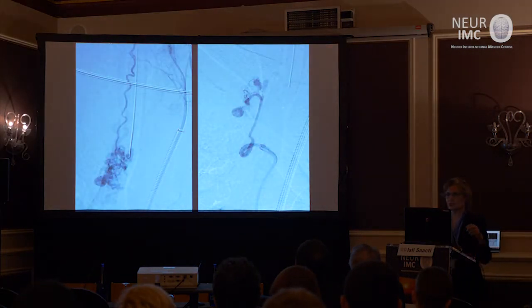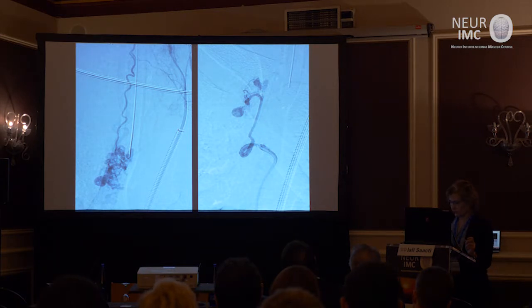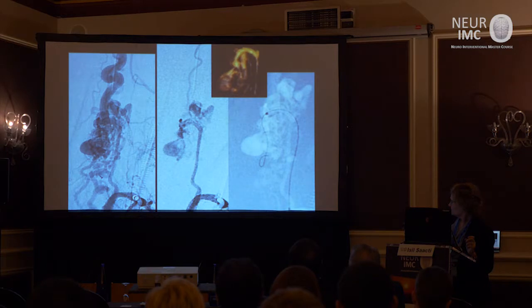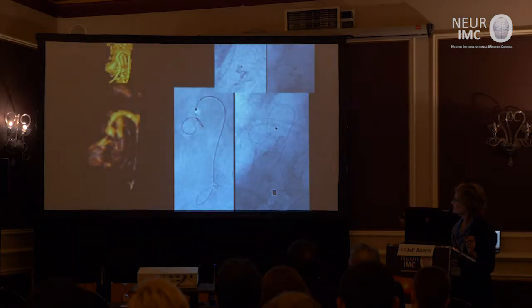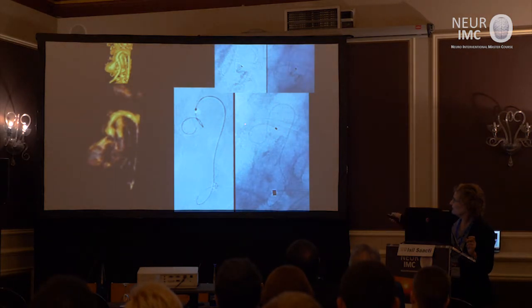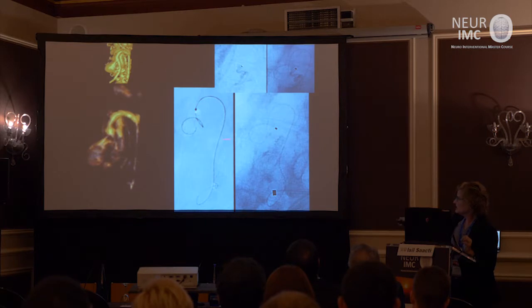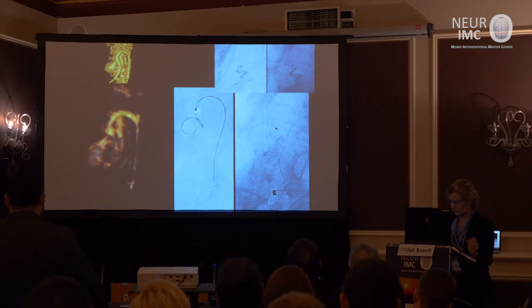So we put guiding catheters into both arteries, costocervical and T4. From the T4, we put our microcatheter all the way to the aneurysm through the sulcal artery. See, this is the continuation of the anterior spinal artery. So we needed to go to that sulcal branch, and that's what we did. We were finally able to catheterize the outlet of the aneurysm so that we could go more distal in that pedicle to safely embolize the vascular malformation as much as possible. And we did a glue injection in this particular patient.